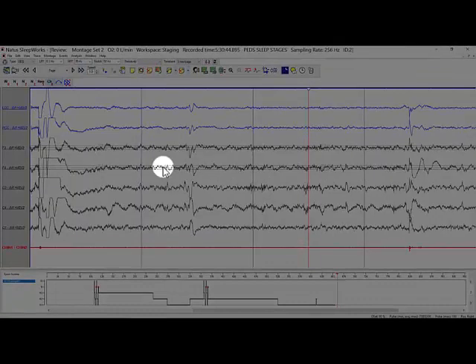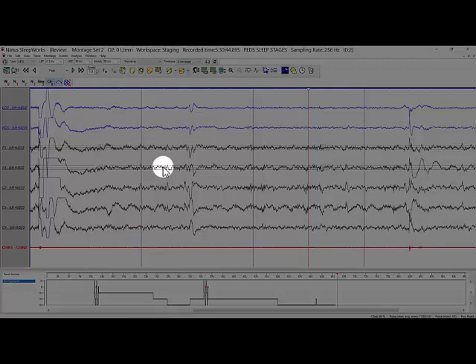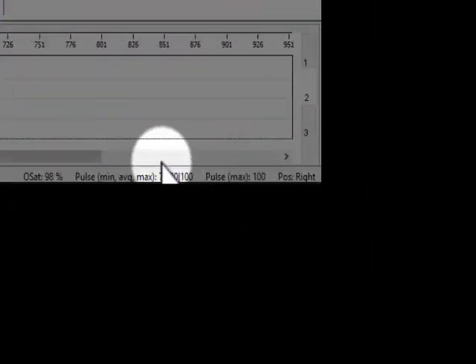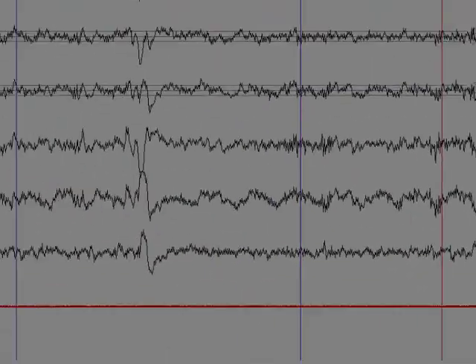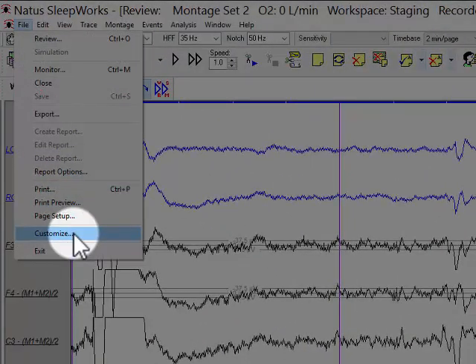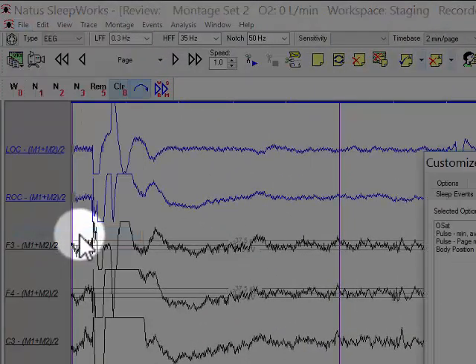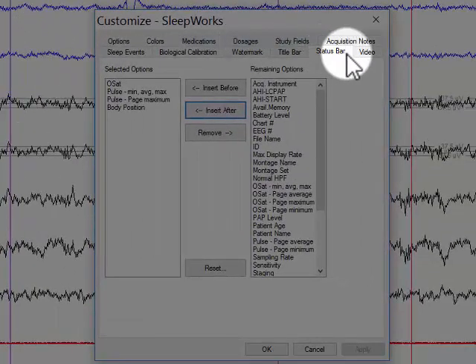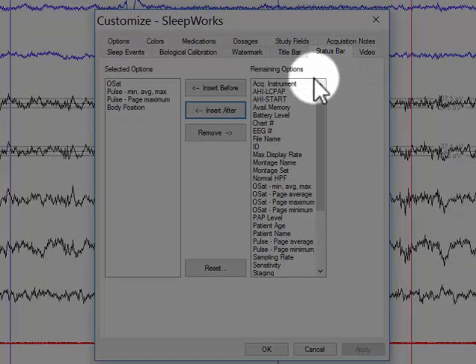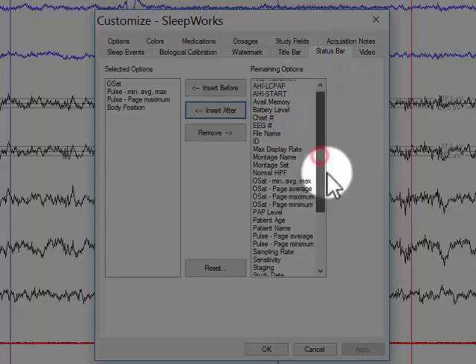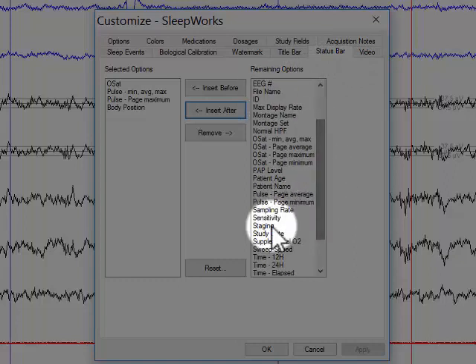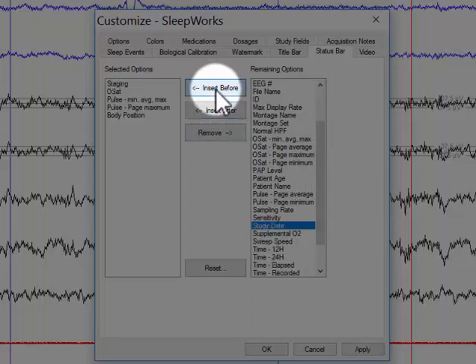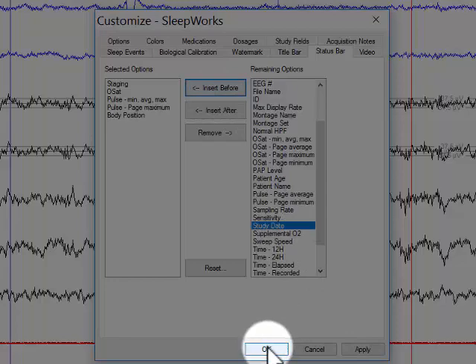In order to show the sleep stages of the previous 15 and next 15 epochs of the epoch you are presently reviewing in the status bar of the review window, go to File, select Customize, select tab Status Bar, and from the remaining options list, select Staging, select either insert before or after, then click OK.